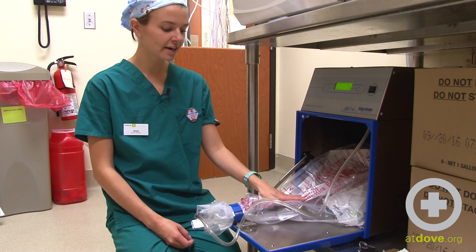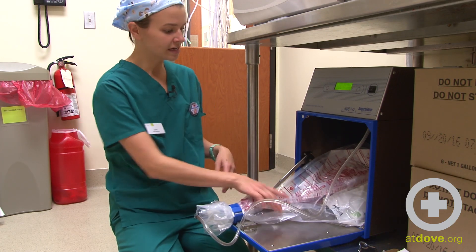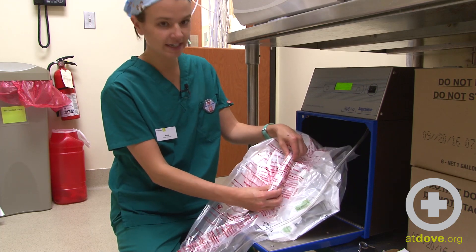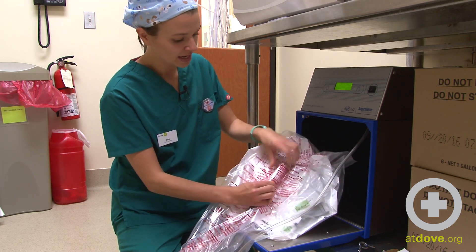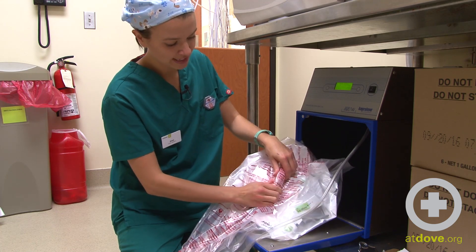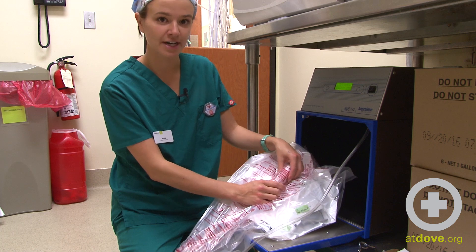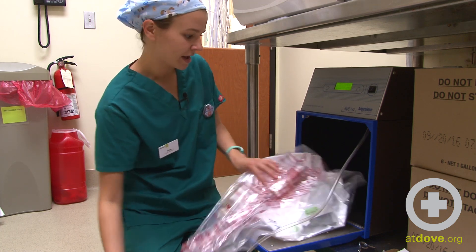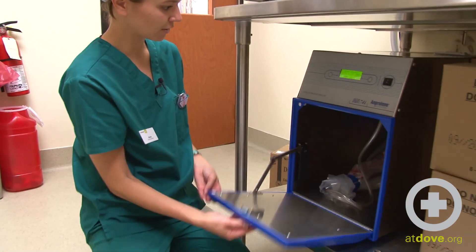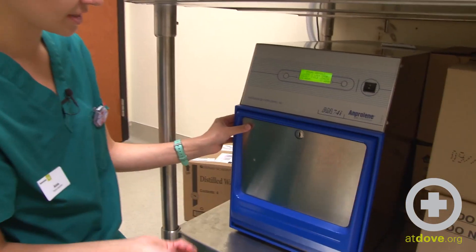Okay, so now that all of the air has been purged from the bag, I'll bring the bag out here, and I can see my ampoule is sitting here on the top of the bag. I'm going to feel for the tab on the end, and I'm just going to break it just like that. I can feel that it got very, very cold, so I know that it broke. And then I can go ahead and push this bag in here, close the door, and make sure it's locked.